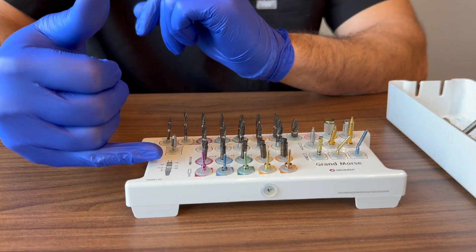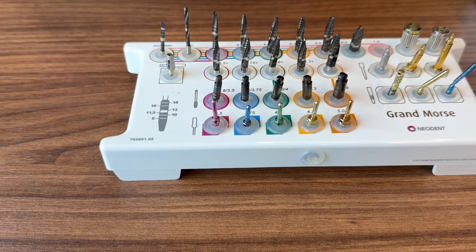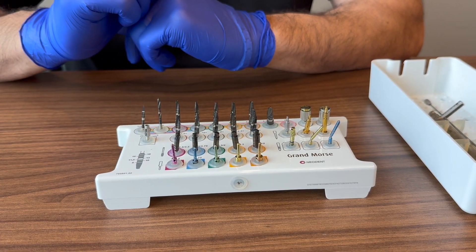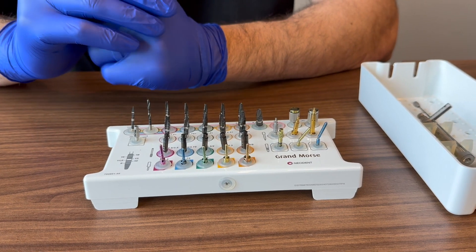The kit also has measurement references printed at the bottom so you can look up the drill markings if you ever forget. That covers everything in the Neodent surgical kit — we'll go over the prosthetic kit next.